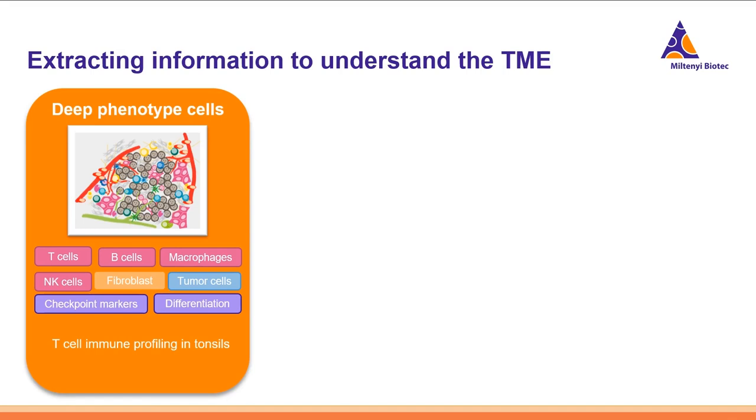If we think back to the beginning of this webinar, we were talking about all those different phenotypes and subtypes of cells that could be in the tumor microenvironment and how these can come together and have different influences on prognosis or also treatments. One aspect we might want to understand from the tumor microenvironment would be something like deep phenotyping those cells. So being able to profile all the immune cells, the tumor cells, maybe even understand certain checkpoint markers in there. And that is certainly something that is obtainable with a technique like this.